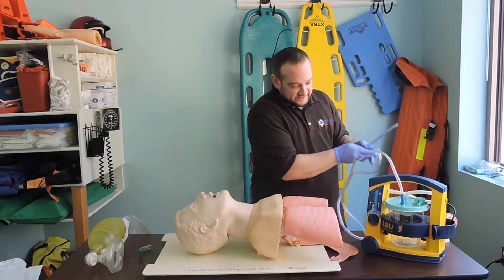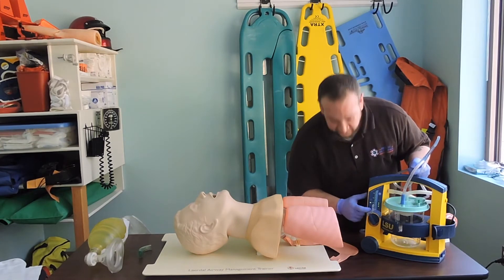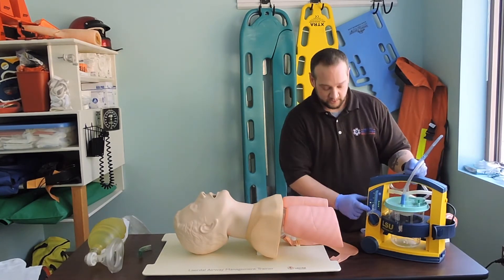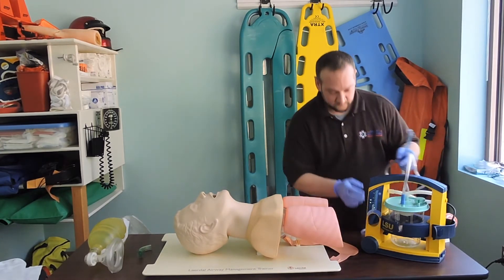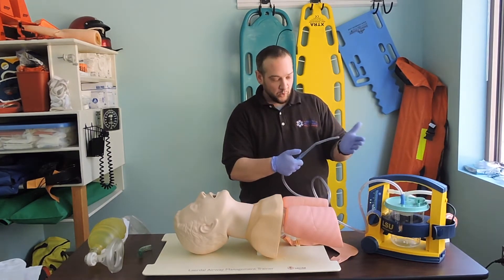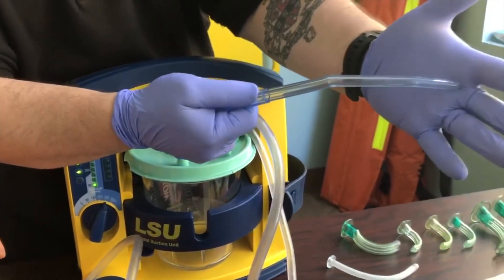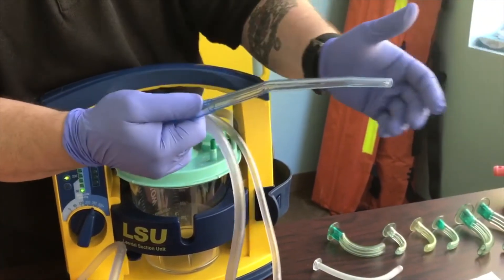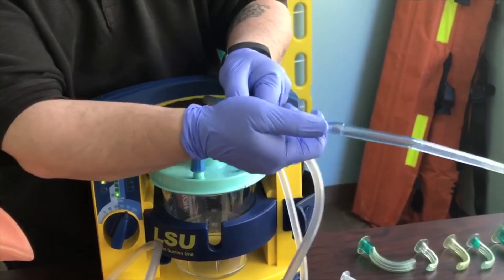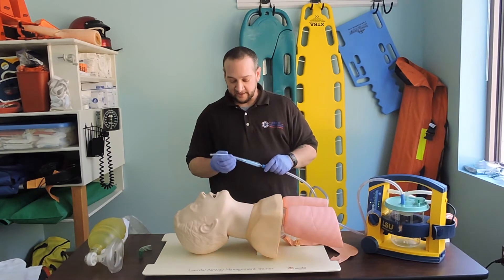On this portable device, we have a dial — our vacuum setting, measured in millimeters of mercury. When we turn this on, if I don't press the thumb port, nothing happens. As soon as I put my thumb on it, you can hear it activate — you can see it start to suck my glove. That's what we want when suctioning an airway.